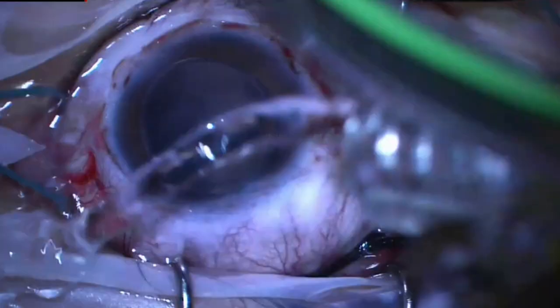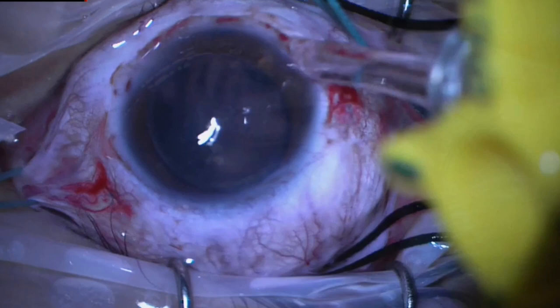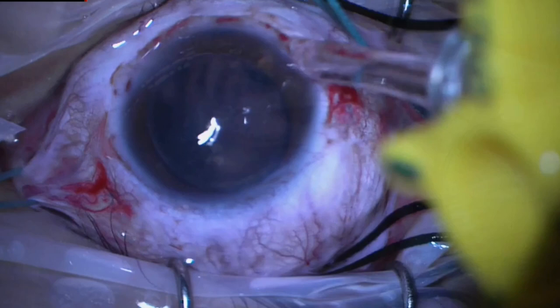The trocars were removed, the silicone oil bubbles washed, and then scleraconjunctival sutures were made. The patient improved visual acuity after one month to 6/30, and this is the aspect of the retina at the one-month follow-up.